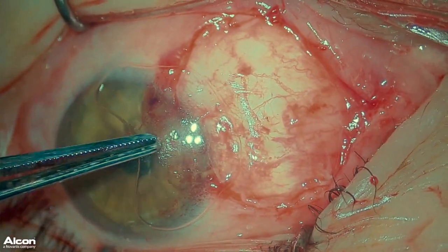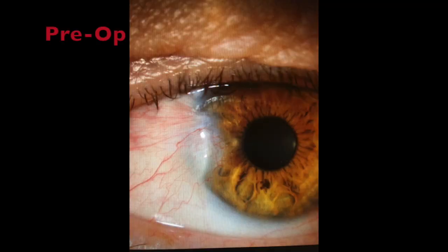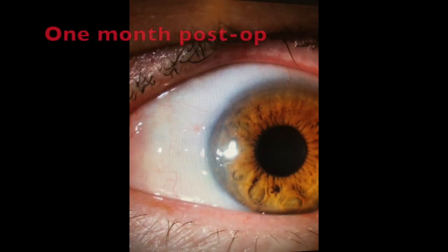I then apply a collagen shield over the cornea, which will dissolve after the first 24 hours. I start the patient on topical antibiotic and steroid drops. You can see the results one month post-op.